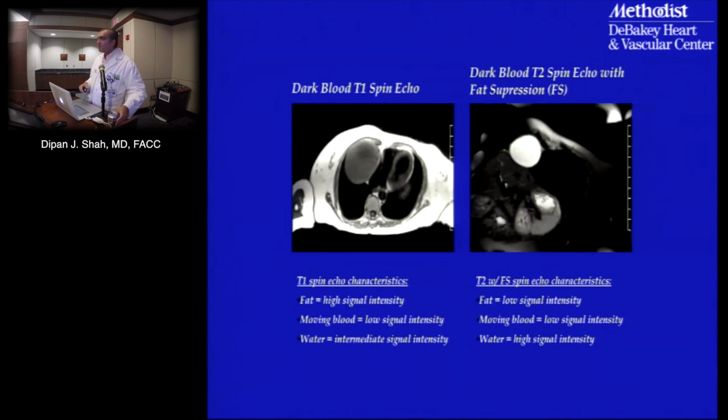Yes, Jeff? So T1 and T2, are they basically inverses of each other? It's not quite a direct relationship, but yes, the T2 time is always shorter than the T1 time of any tissue. There's an indirect kind of inverse relationship, but it's not one-to-one.